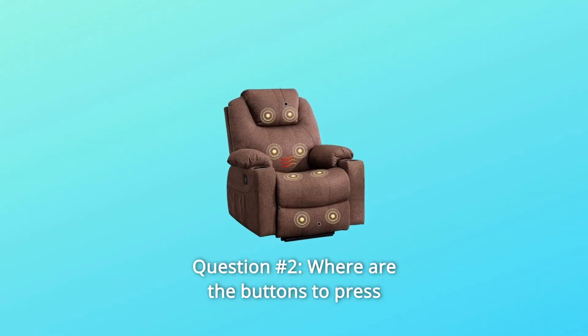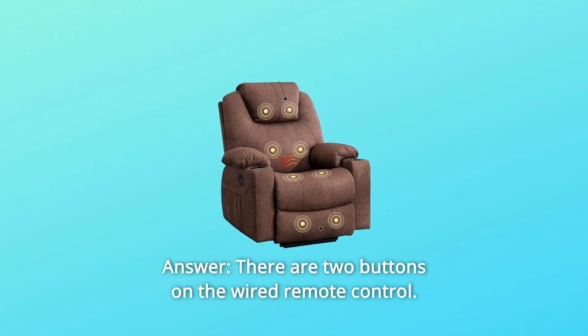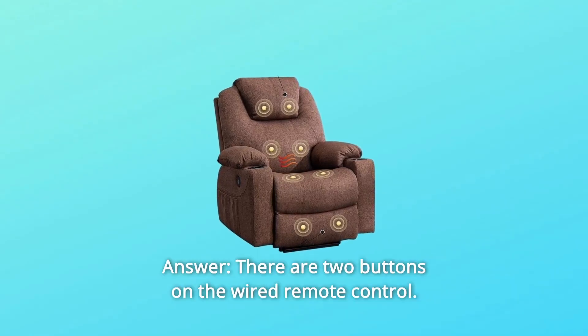Question 2: Where are the buttons to press? Answer: There are two buttons on the wired remote control.